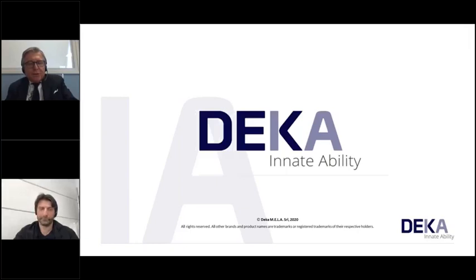Why? Because all the advantages that we can have with the laser can be lost. So it's very important to use SP pulse, not continuous.